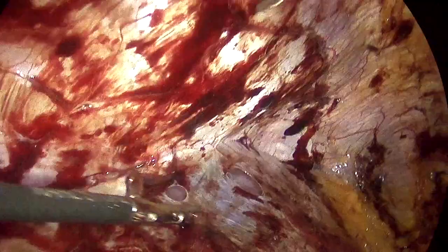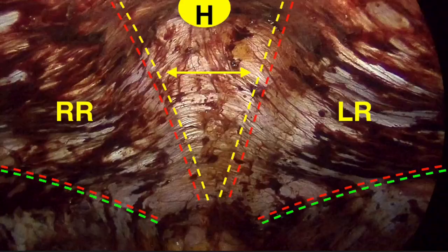You get to see the hernia defect, the diastasis, and the retrorectus space on both the left and right-hand sides. This was a very nice case to illustrate the non-inverting plication because this lady had quite a weakened midline.